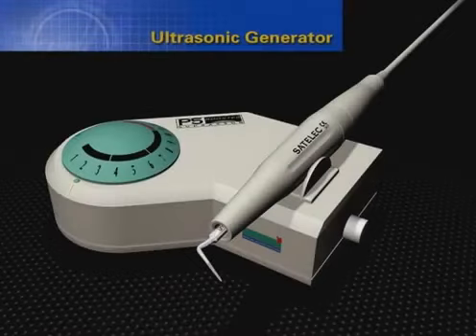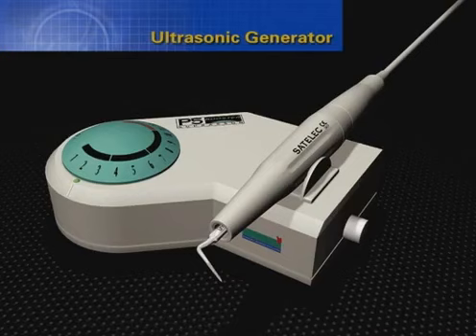The P5 piezoelectric ultrasonic unit provides unmatched power when performing endodontic treatment and retreatment procedures. This unit affords precise working accuracy and a broad power range, and its unique feedback system enhances safety by automatically regulating tip movement.